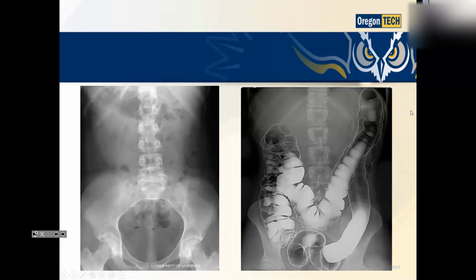With the contrast media in there, we have higher contrast. Now, this patient's in a specific position right now. Anybody know? Are they supine? Are they prone? Are they on their side, or are they standing up? Prone. I've heard prone and on their side. I'm going to say prone as well. You're going to go with prone?